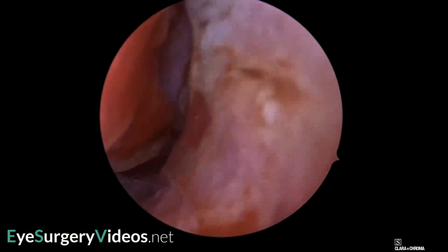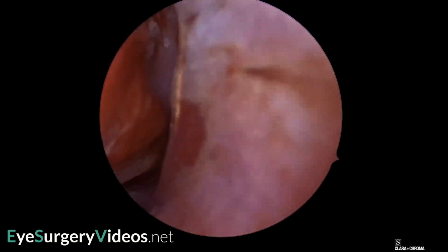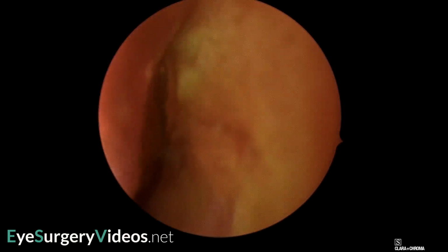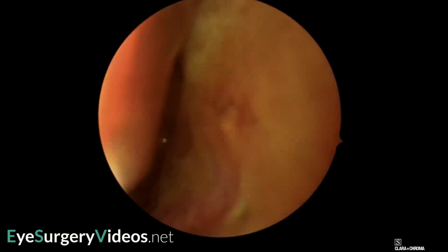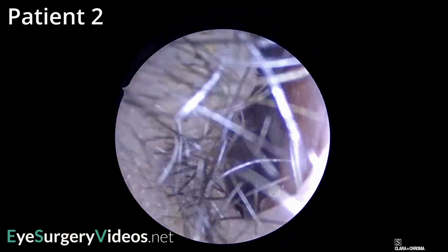This is another demonstration of the metal probe pushing against the nasal mucosa from the inner false route. Finally, another example of the system patency with fluorescein wash. Another proximal probing is shown in this second patient.